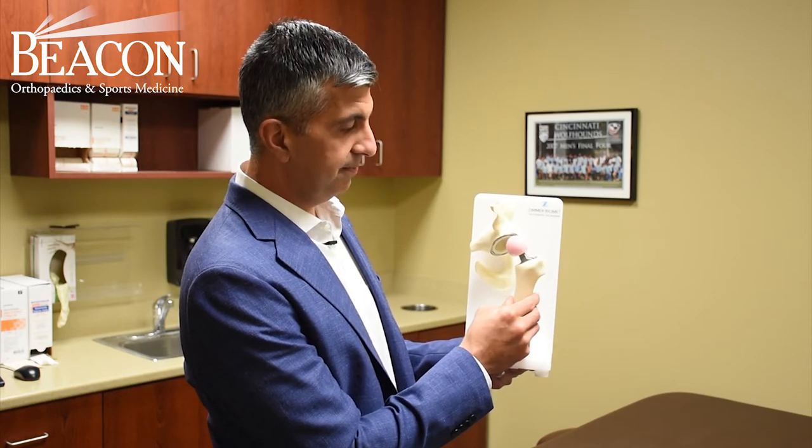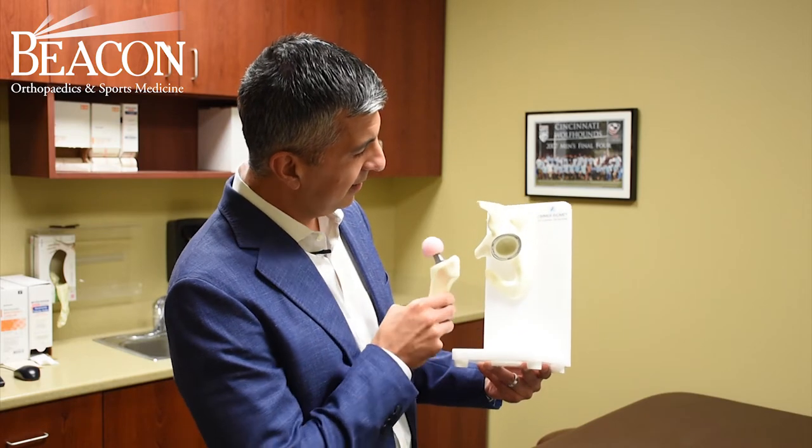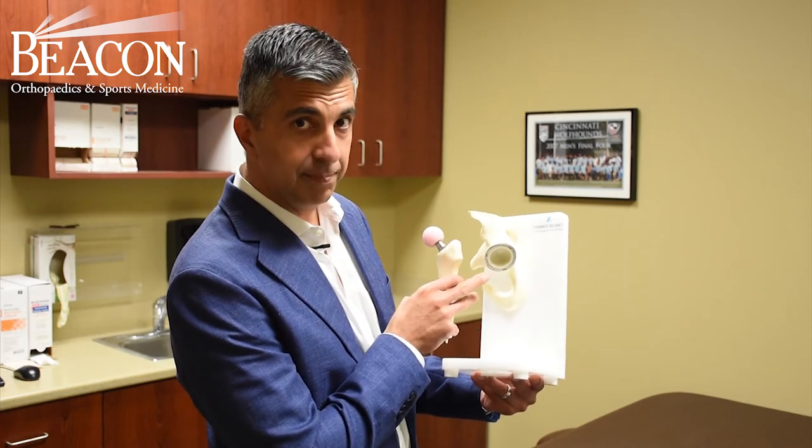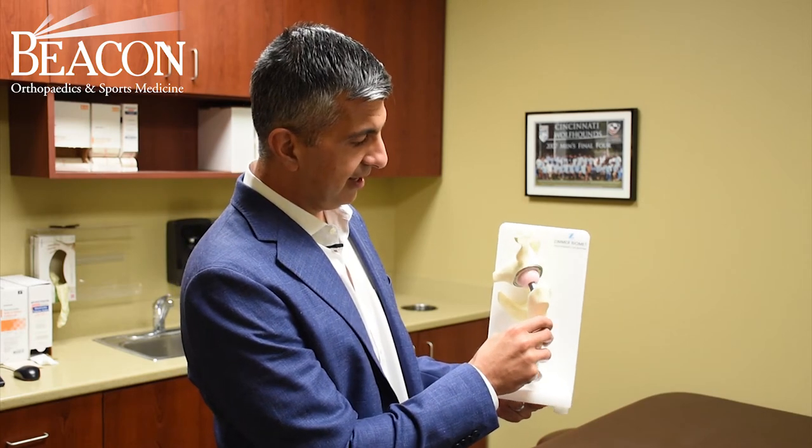It is pink in color, just like you see in the model here, and it articulates with a polyethylene or a plastic socket, and it fits together like this.